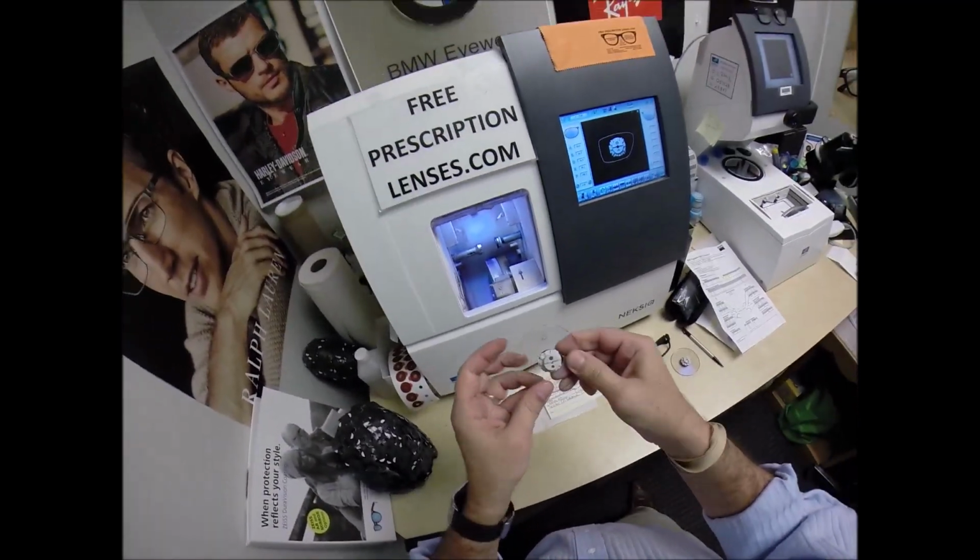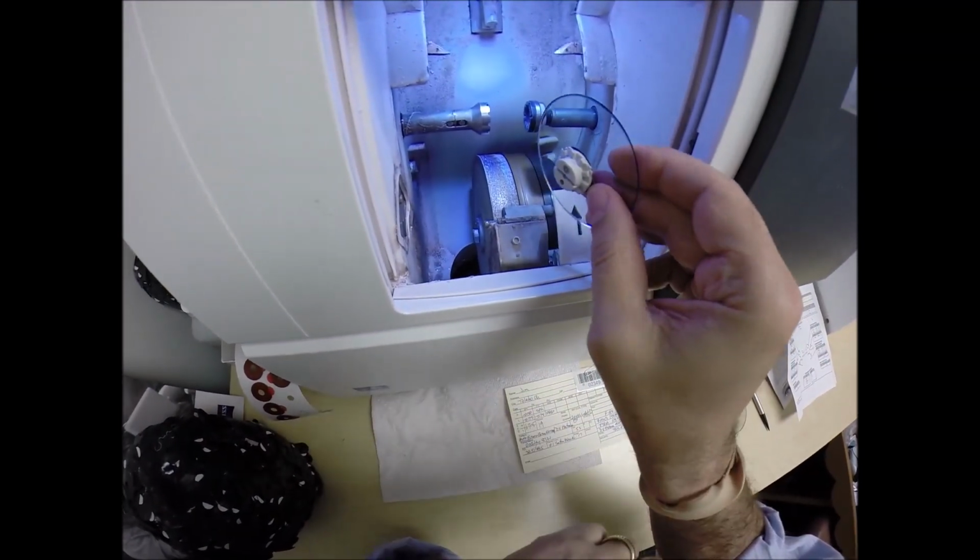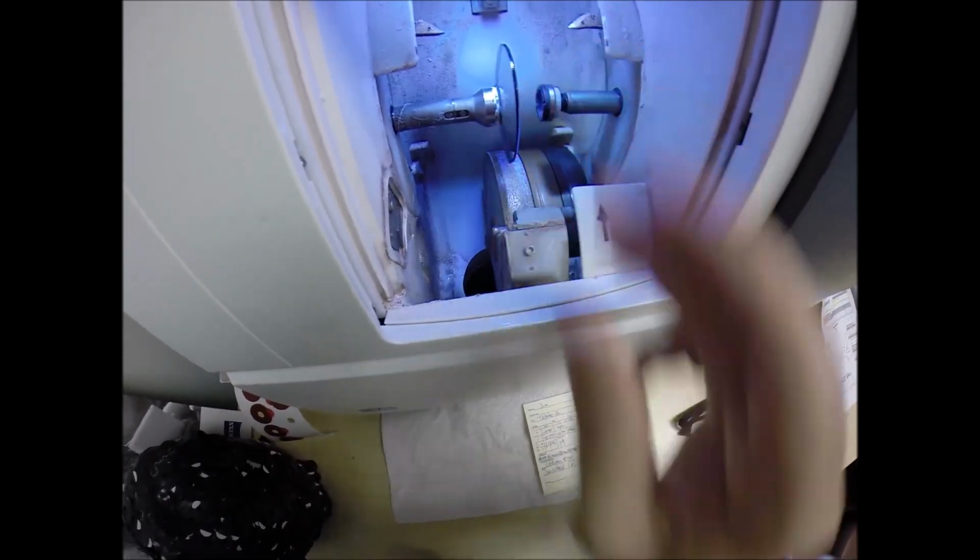So now I'm going to press the magnet on there firmly. The magnet's going to go, or the block. Now the magnet's going to do its job a second time. It's going to attach itself to another magnet there in the chuck.